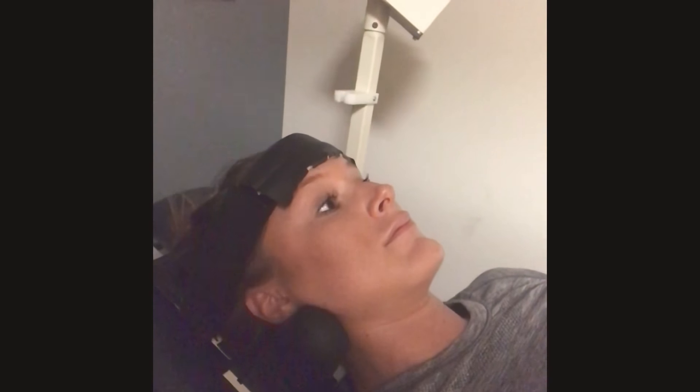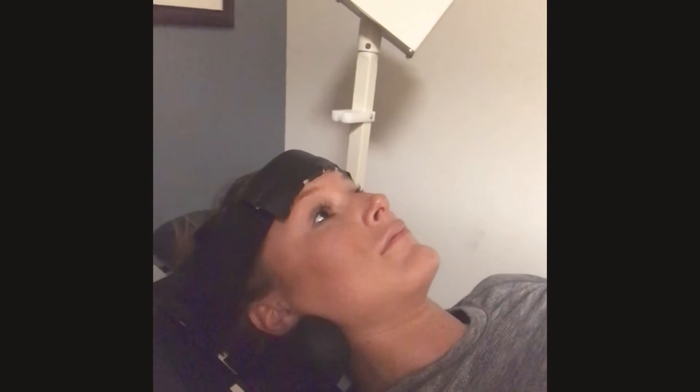Hello everybody, it's me, the girl in the halo. So this is me using the traction machine at my physical therapy office. Basically, this machine has two knobs on each side of my head along with the head strap, and it's just pulling my neck away from the body, if that makes any sense.